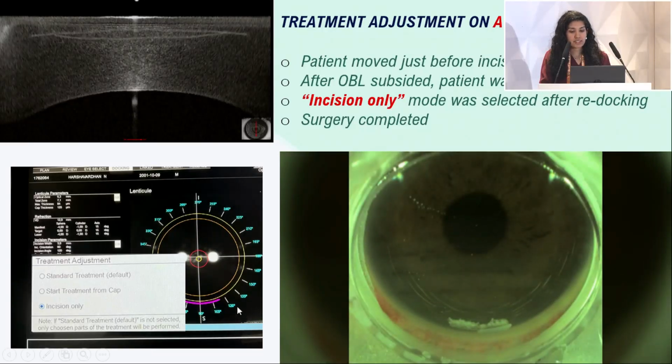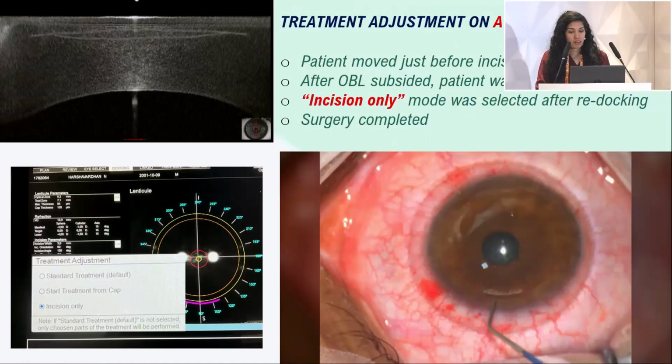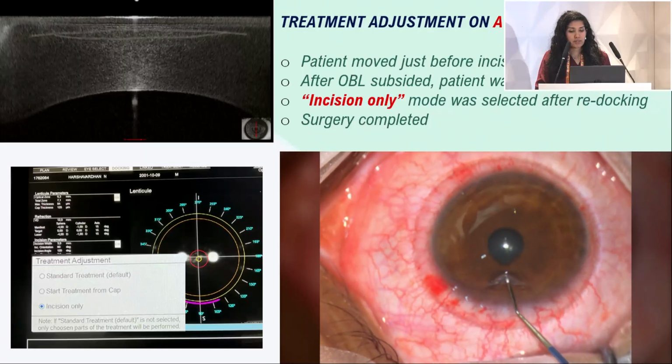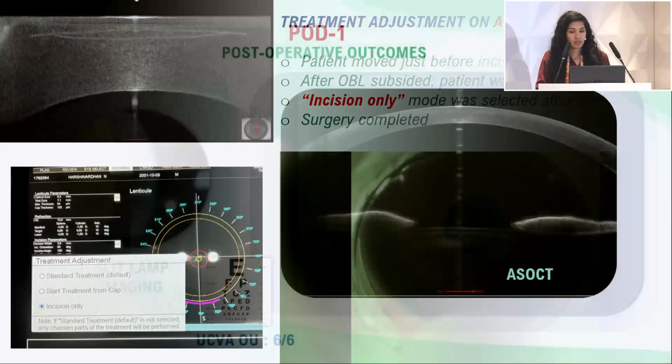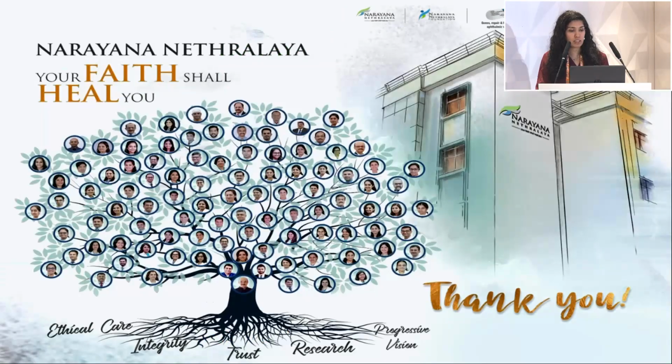So here we can see just the incision was created, and we have been able to extract the lenticule. So post-operative outcome was still 6-6, and this is the ASOCT, minimal interface edema. So that was the case that we encountered with Schwind ATOS.